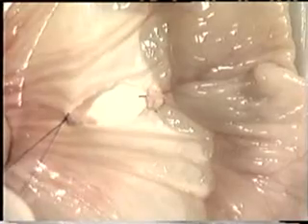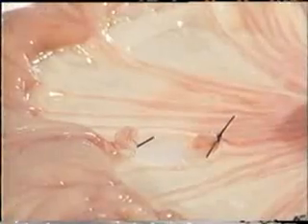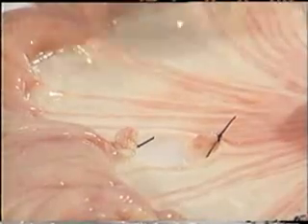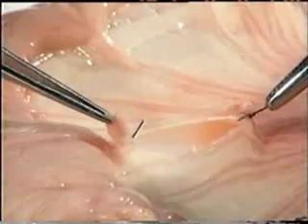A similar tie is placed around the other hemostat, and once again instructions given to the assistant to release the hemostat once the first throw is satisfactorily tightened down. Two more throws can be placed, laid properly, and then the suture material cut. This technique is suitable for pedicles throughout the body.